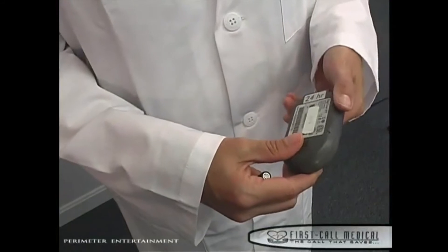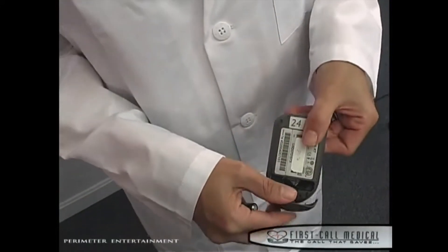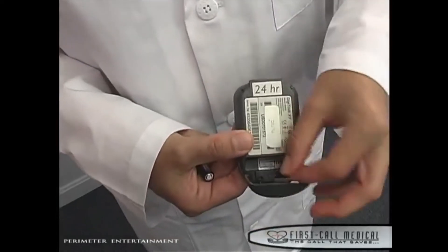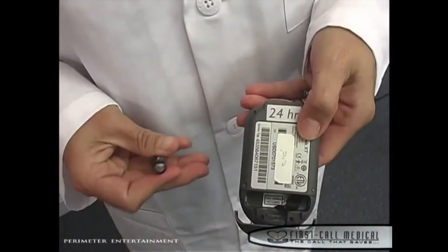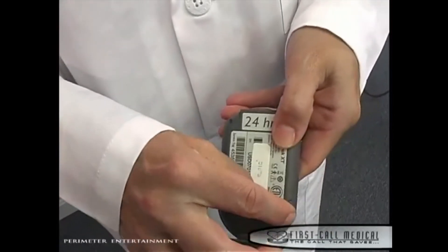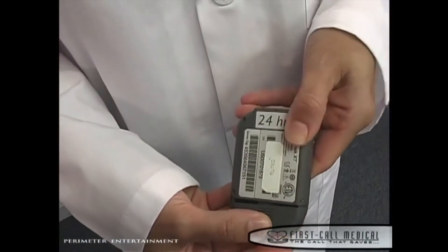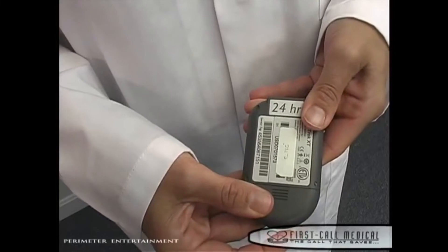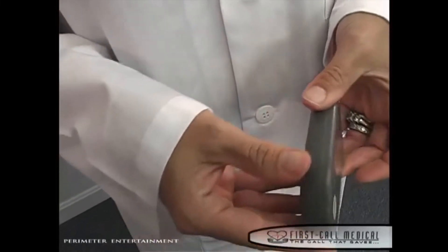Open the battery compartment in the back of the monitor by sliding the latch. Dangle the cloth strip outside the monitor and insert the AAA battery on top of the cloth strip according to the polarity diagram located inside the monitor. Once the battery has been inserted, slide the latch closed. It is important to note that the patient should not remove the battery for any reason during the recording process.